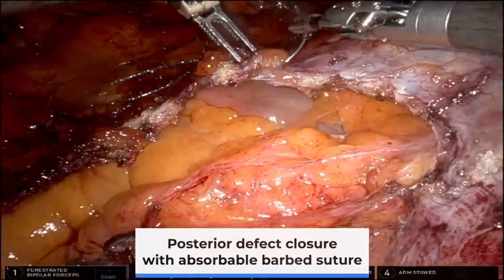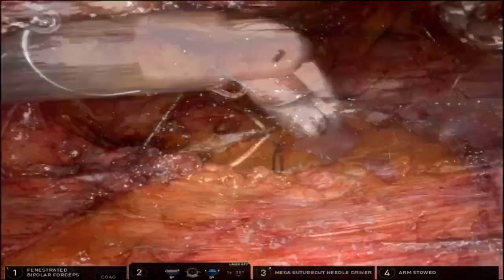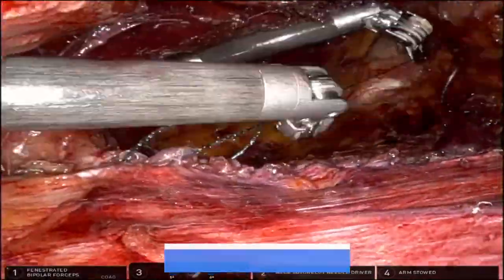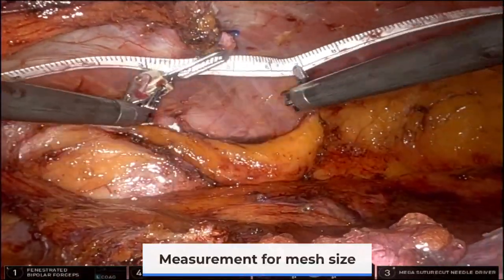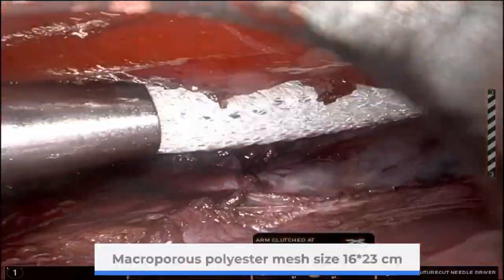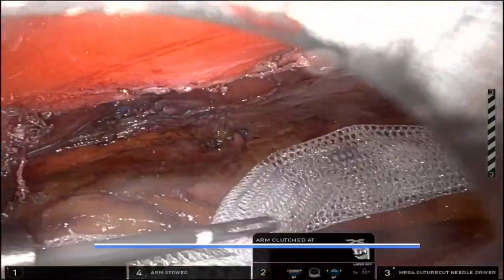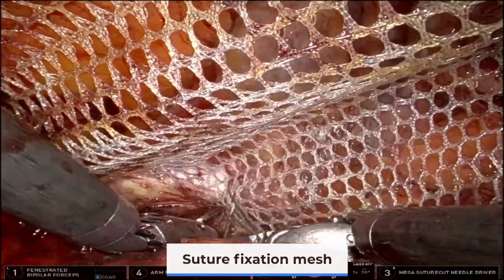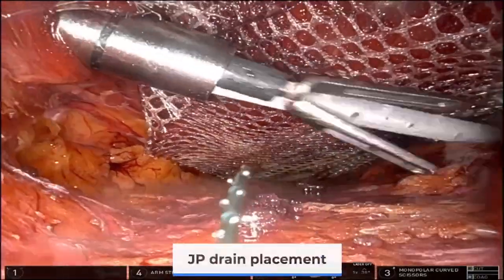Posterior defect closure with absorbable barbed suture. Finish posterior closure. Space was measured to design mesh size. Macroporous polyester mesh, size 16 by 23 cm, was placed. Suture fixation of the mesh was performed. A JP drain was placed.